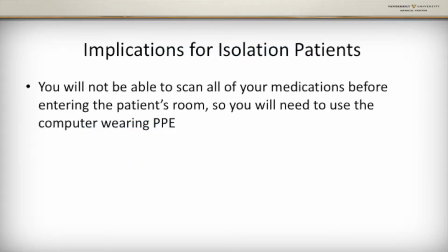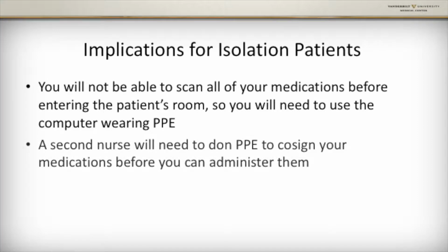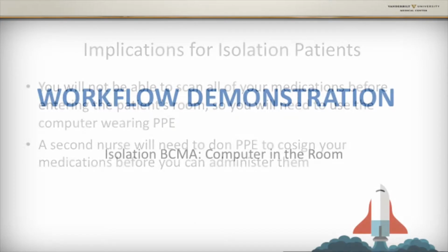These changes will have the biggest effect when dealing with isolation patients, as it means that you will not be able to scan all of your medications before entering the patient's room, and a second nurse will need to don PPE to co-sign your medications.